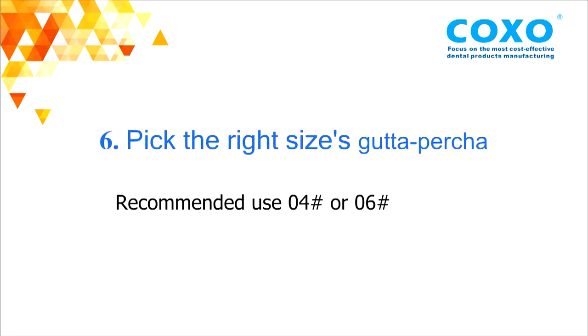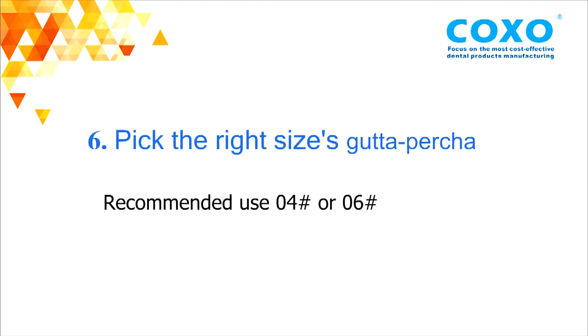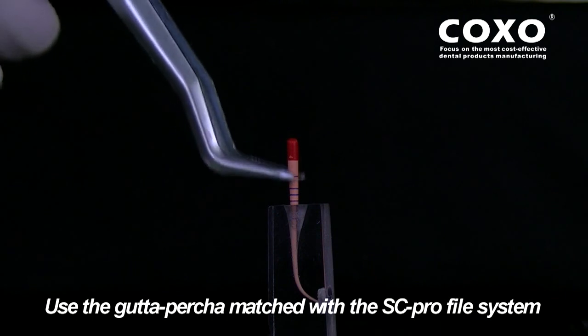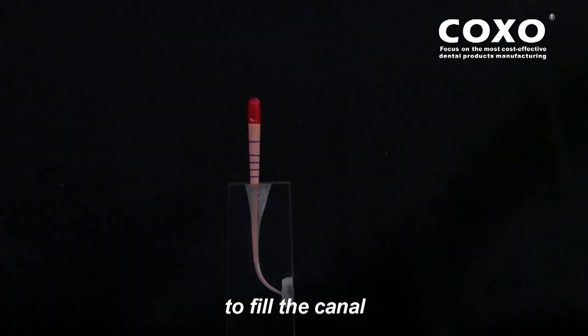Step 6: pick the right size gutta-percha. Use the gutta-percha matched with the SC Pro System File to fill the canal. SC0265 System File.